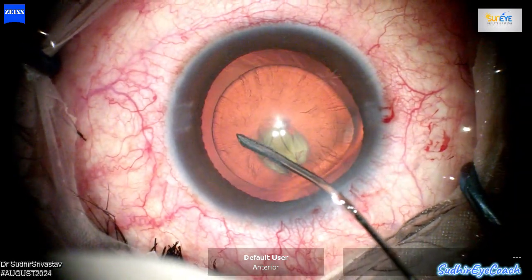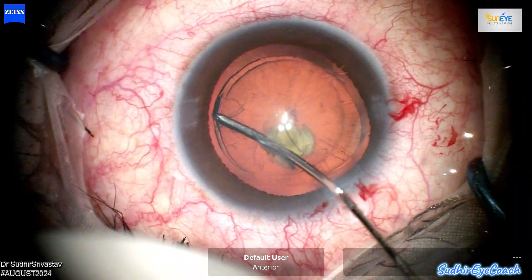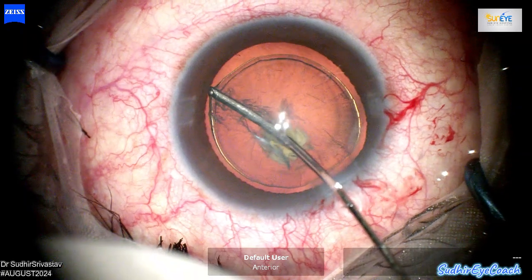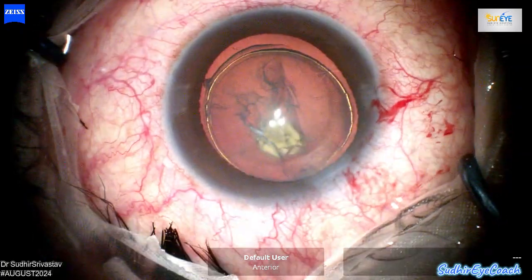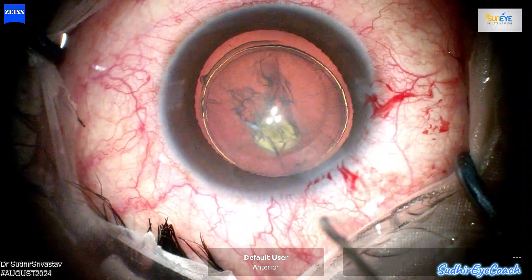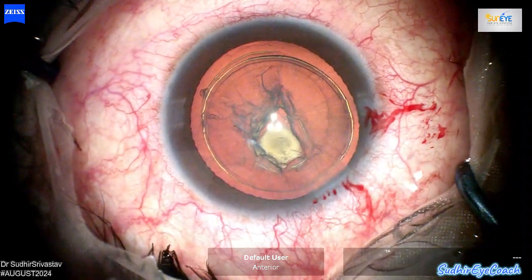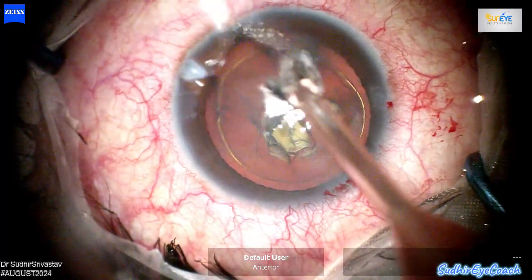In posterior polar cataracts, hydro-delineation is crucial. Hydro-procedures play a significant role, but you should avoid hydro-dissection. Since the posterior capsule often already has defects, performing hydro-dissection can worsen or extend the tear. Instead, focus on careful hydro-delineation to separate the nucleus while minimizing stress on the already compromised posterior capsule.